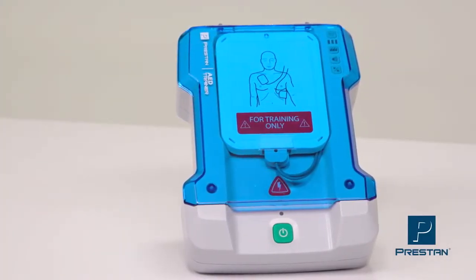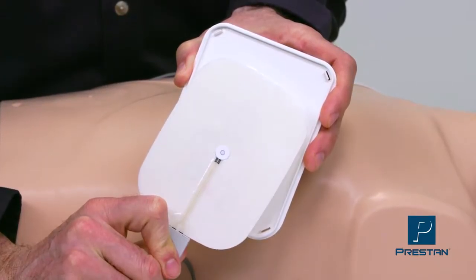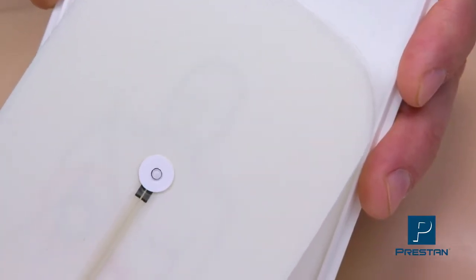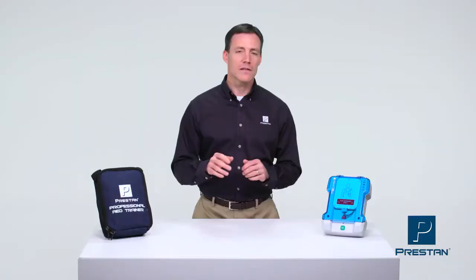Preston's unique pad sensing system automatically detects when each pad is placed on the mannequin. This most accurately simulates a live AED, allowing for a more realistic training class. It also eliminates the need for a remote.